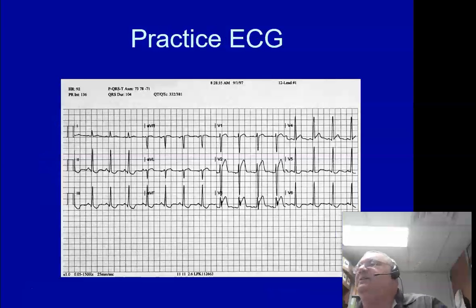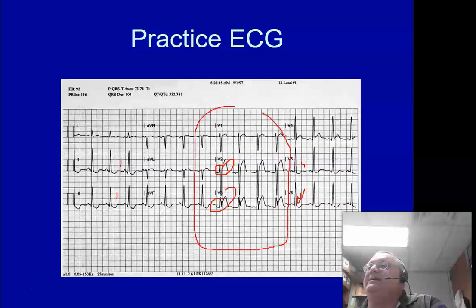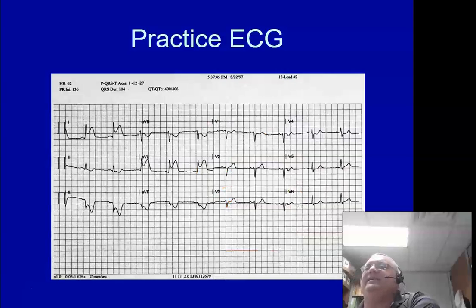All right, so to give an example here, let's see here. Let's start circling. Yep, that's up. Yep, that's up. Let's see here. Not too bad, not too bad. Depression, depression, depression, depression. So is this a septal anterior infarct? I would say yes, it is. And remember when I kept saying to you guys that these two kind of go together? Most definitely. Most definitely, I would say it's affecting that part of the heart. Let's go ahead and take him to the cath lab.